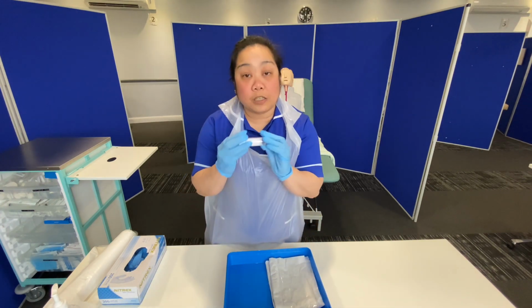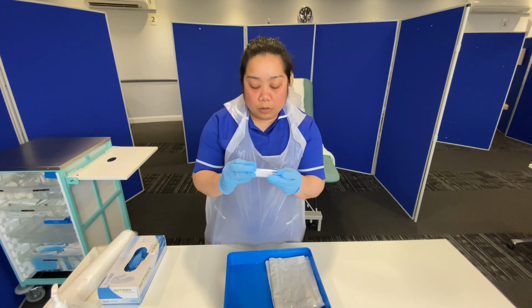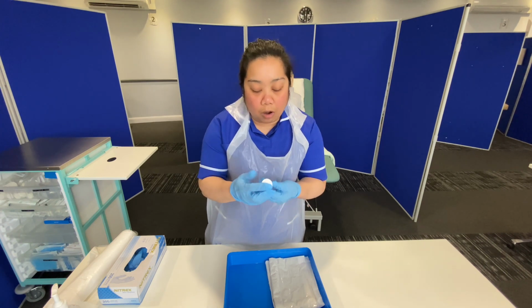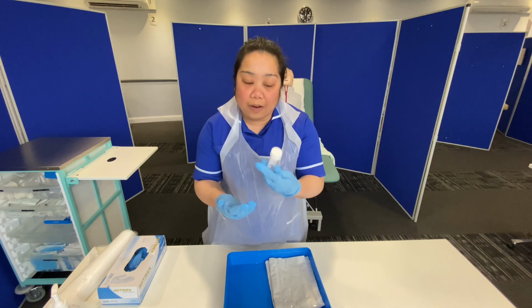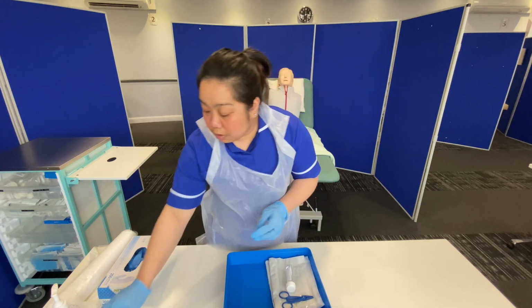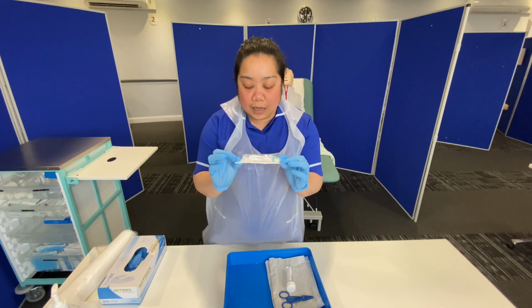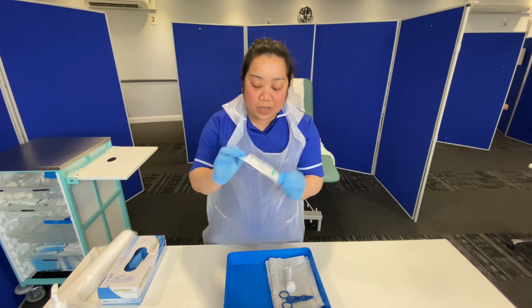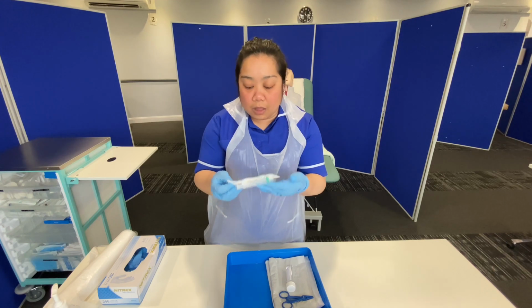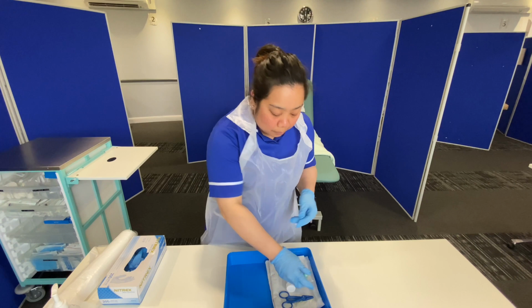We will need a specimen bottle, intact, dry, and within date, so it expires 2024. I'm happy to use that. There are no discolorations whatsoever. We will need a non-traumatic clamp, a 10 ml syringe in a packaging that is clean, dry, and intact. There are no discolorations that are noted inside the packaging and within the equipment, and it was within date 2026. I'm happy to use that.